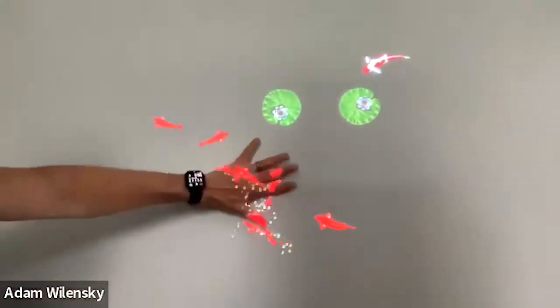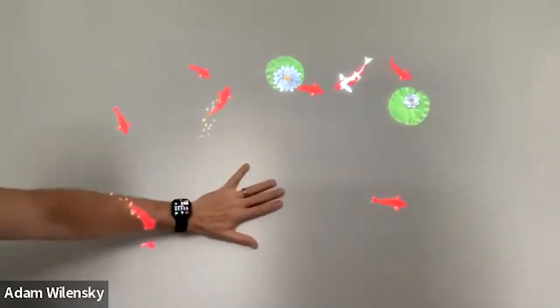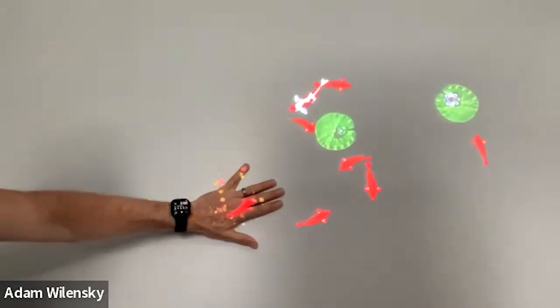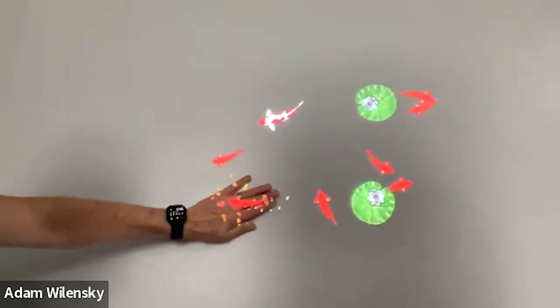This is a fish game from level 2. The sensors are going to pick up that movement of my hand. Now, if I'm holding my hand out and the fish aren't swimming by, or even better yet, you see the food forming on my hand, the fish coming by to nibble it. If that's not happening, the reason is because the sensors need to be calibrated.